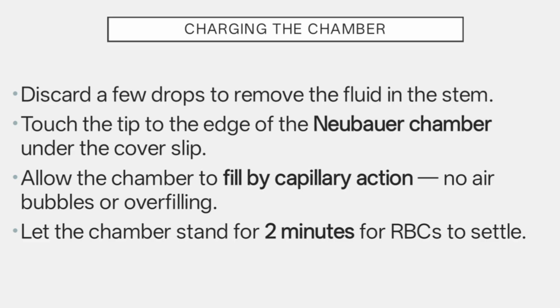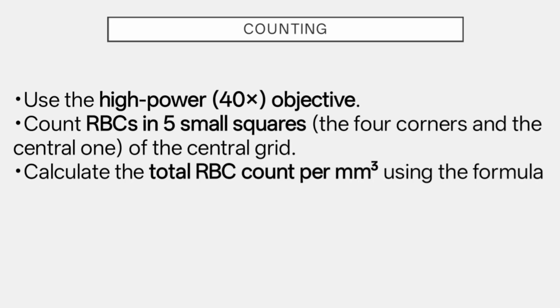Touch the tip to the edge of the Neubauer chamber under the cover slip. Allow the chamber to fill by capillary action, with no air bubbles or overfilling. Let the chamber stand for 2 minutes for the RBCs to settle. So this is known as the charging of the Neubauer chamber.